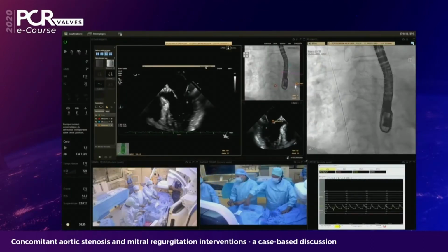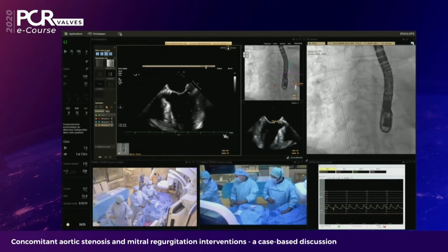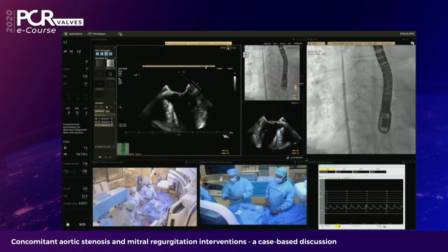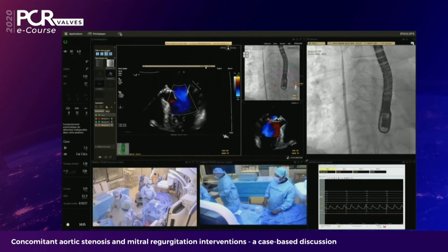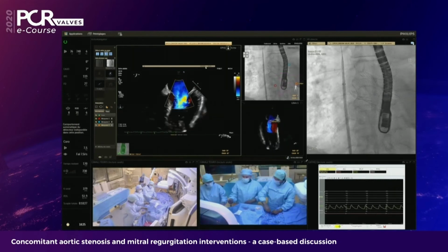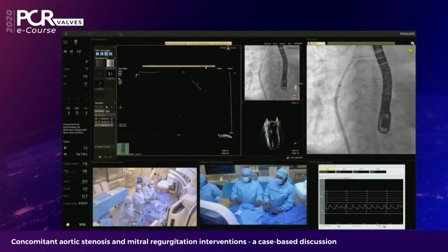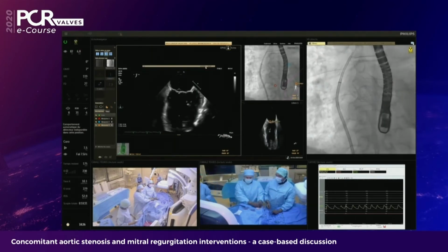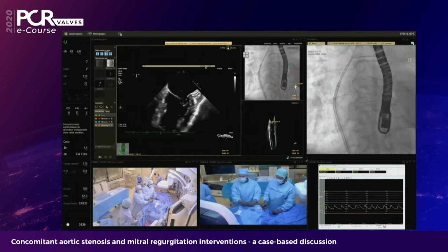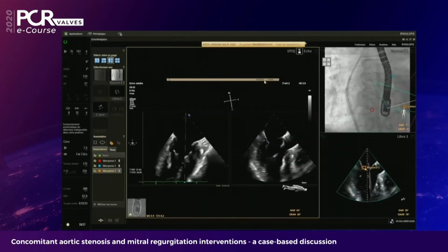Hi everyone, I'm Stephan. I'm very happy to be here with you to comment on the MitraClip procedure. For investigating this mitral valve, obviously by adding the color we have severe mitral regurgitation, which was appreciated previously by TTE. There is no doubt of the severity of the regurgitation, but now we have to go further in describing the lesion of this valve, and from this bicommissural view I'm adding the extended view on zone 2.